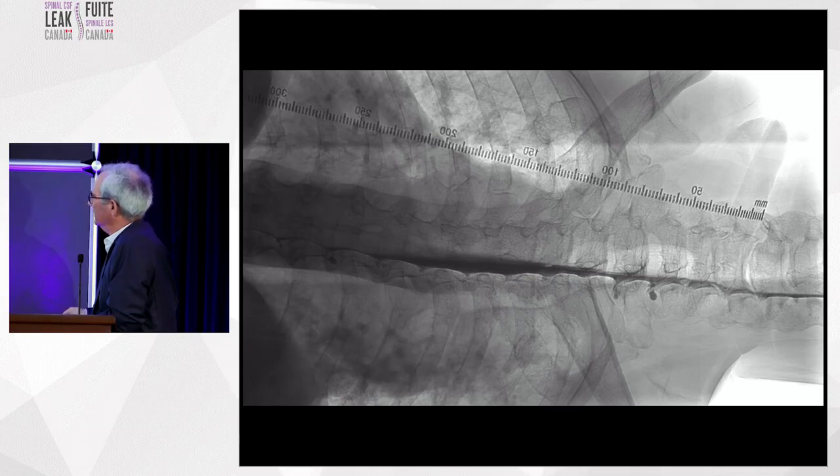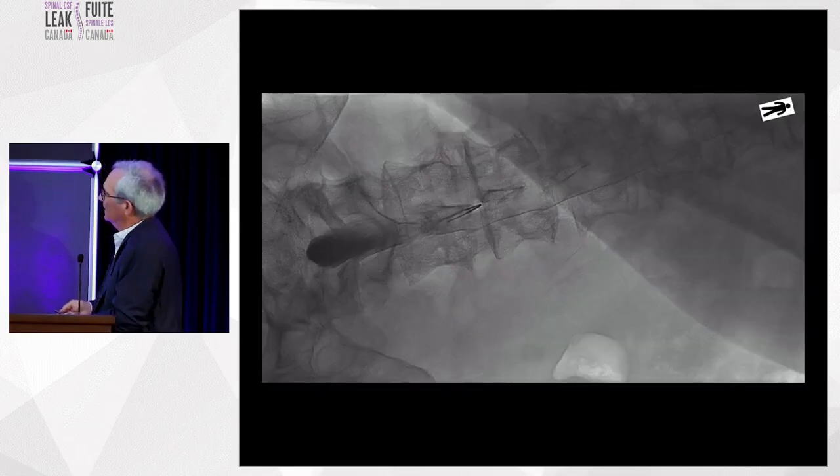Don't let the contrast material dump into the head. Keep the head tilted up on sponges and bolsters. And you image the entire spinal canal that way. At the end of it, we get the patients up on their elbow, head towards the ceiling, and get the contrast material down into the lower sacral region to look for sacral tears and even fistulas.